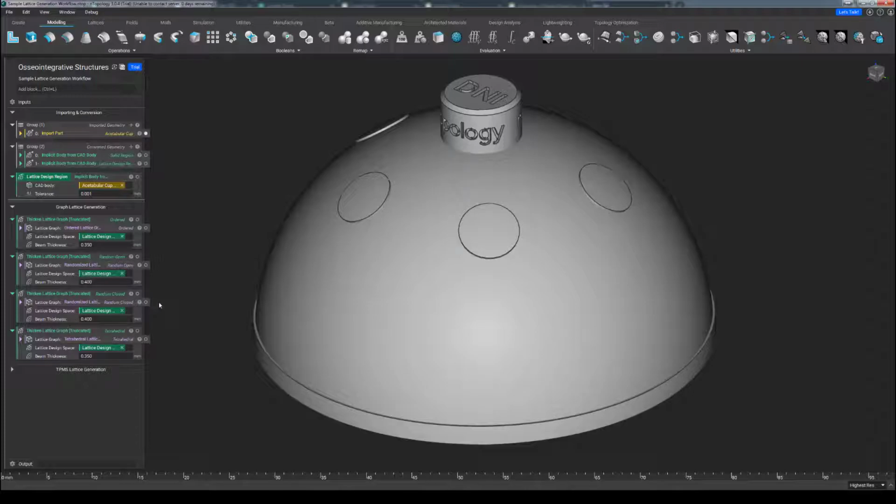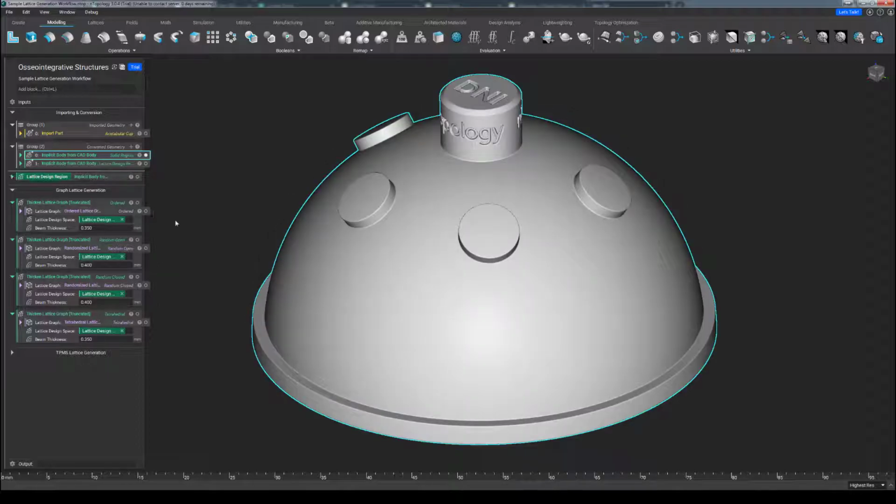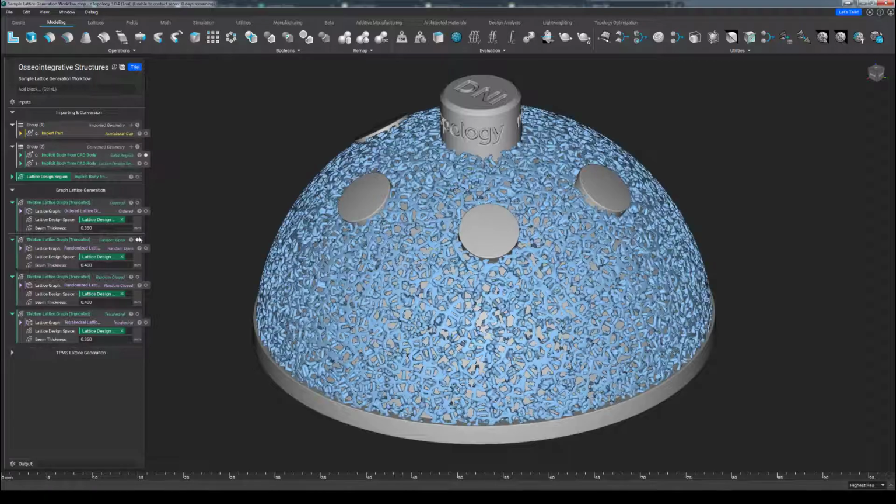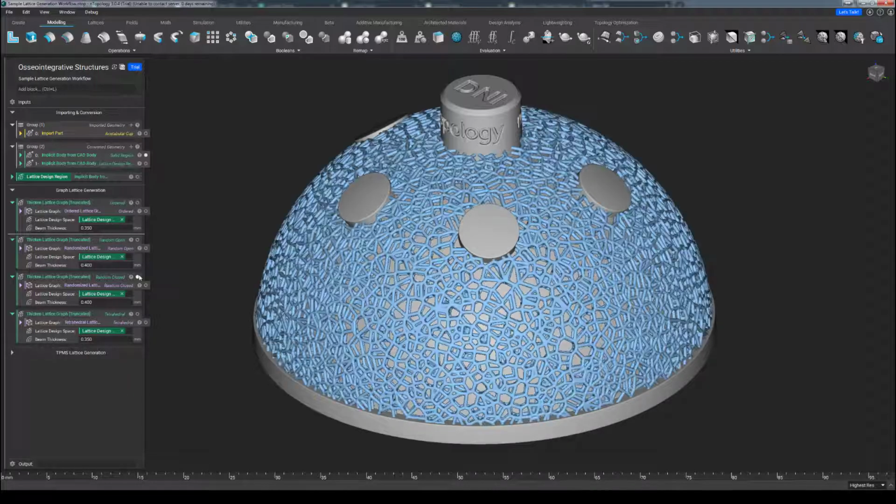So, looking at our graph lattice generation section, we can see four graph-based lattice structures. These are the ordered lattice, the randomized lattice open cell variant, the randomized lattice closed cell variant, and the tetrahedral lattice.